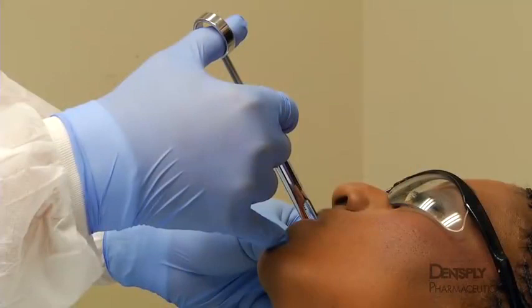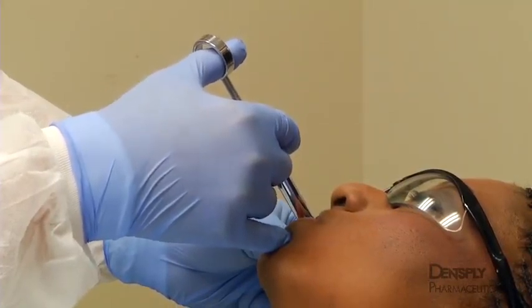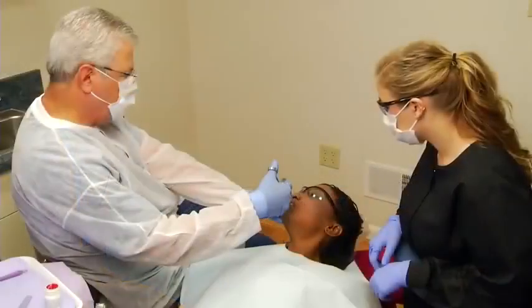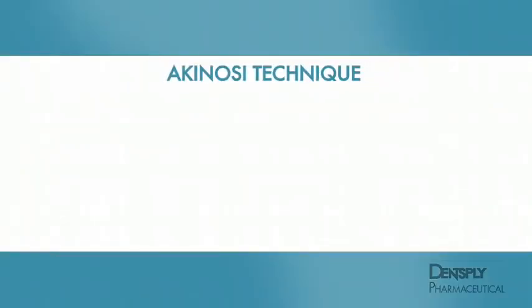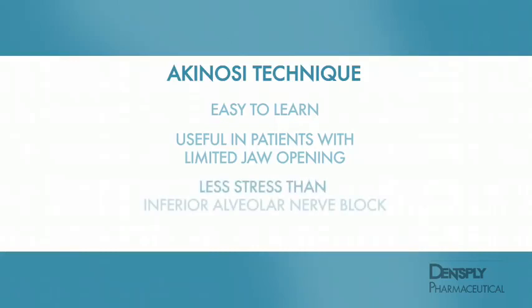As the needle is slowly advanced to its ultimate depth of 2.5 centimeters, a few drops of anesthetic can be administered to reduce discomfort during insertion. After a negative aspiration is obtained, the entire cartridge is slowly injected. Although the closed mouth technique is essentially a blind injection, it is technically easy to learn and of great advantage in the patient with limited jaw opening. It is also perceived by some patients as less stressful than the standard inferior alveolar nerve block, yet comparable in onset time and anesthetic efficacy.